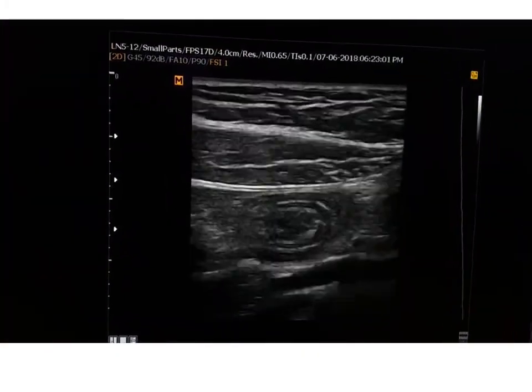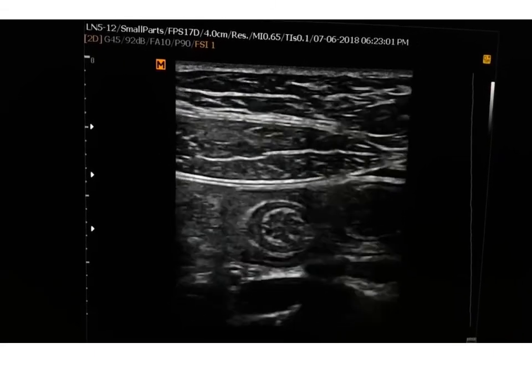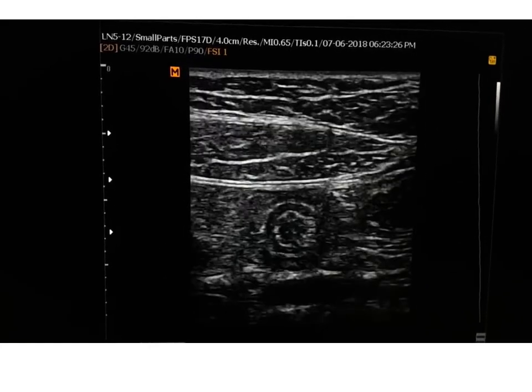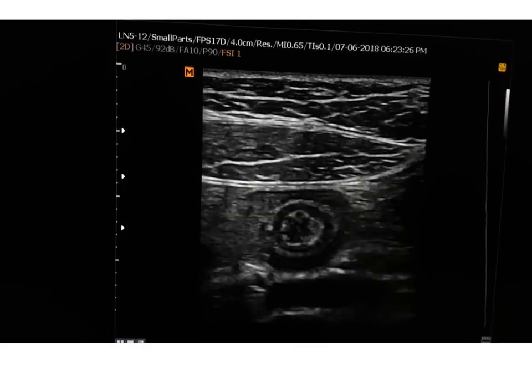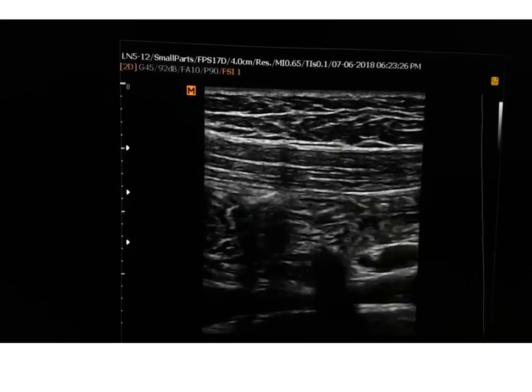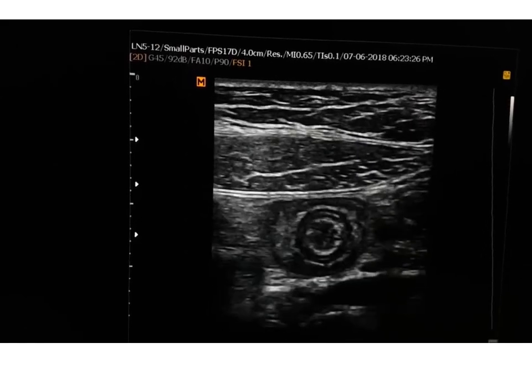So this is a case of ultrasound. You will see there the target sign. It's very classic. And the report should come back like that. So it's 100%: the first thing you have to request in case of intussusception is ultrasound. Remember that always.